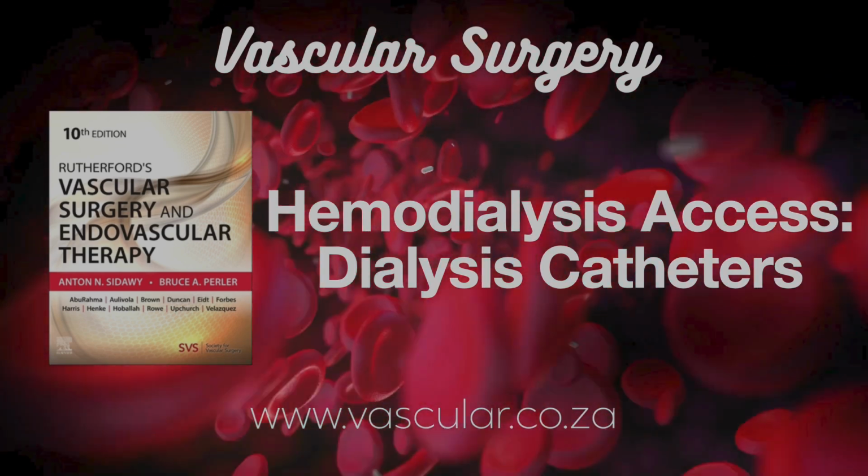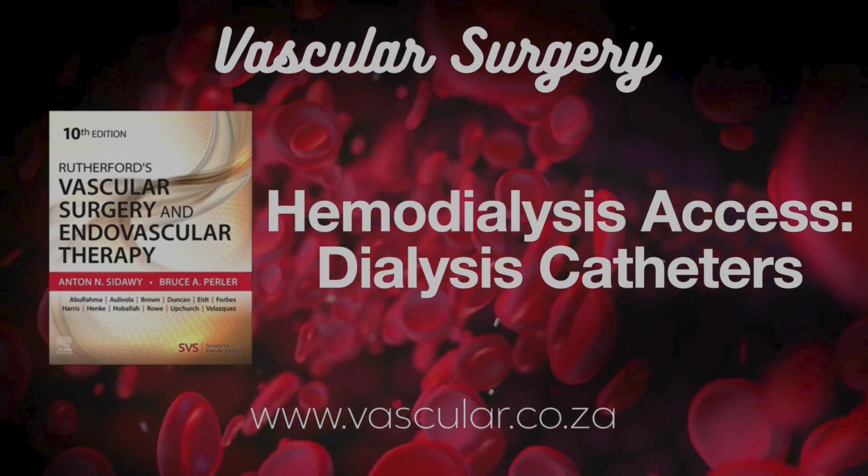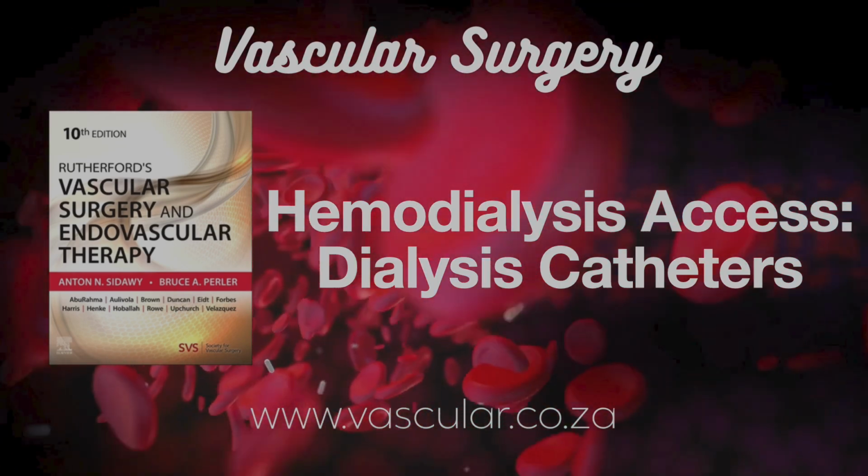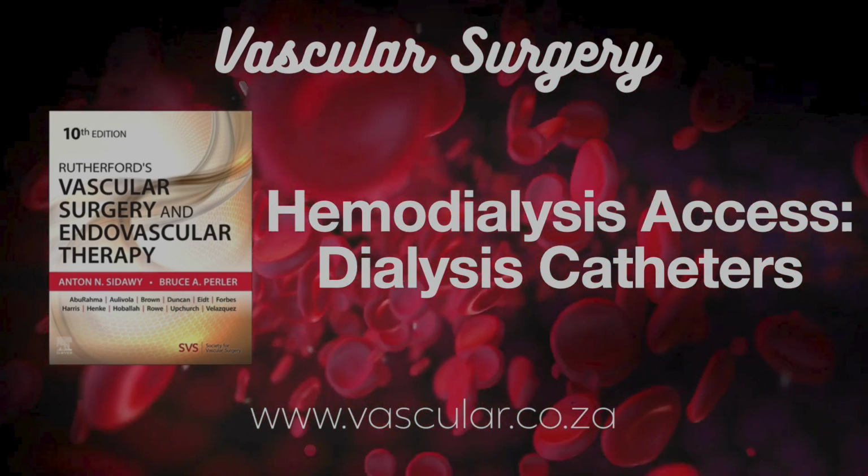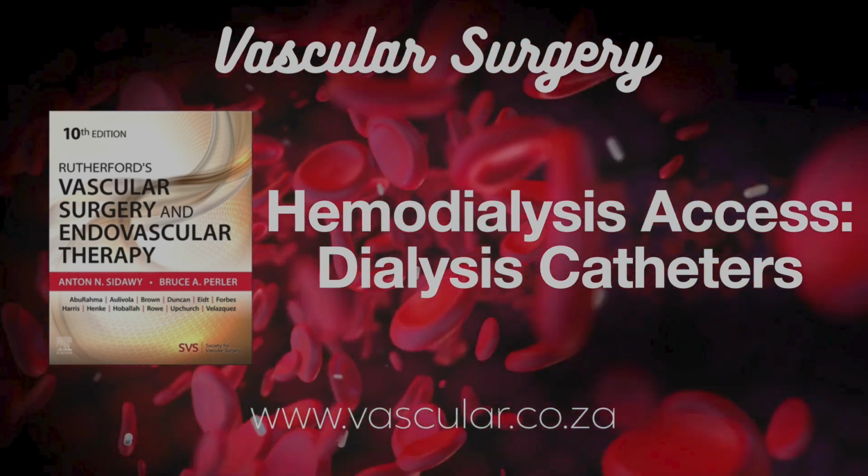In central venous stenosis, the vein narrowing. We touched on that risk with subclavian lines. Right. It's from chronic irritation by the catheter. Definitely higher risk with subclavian access. Avoid it if you can. How does stenosis present? Can be silent.